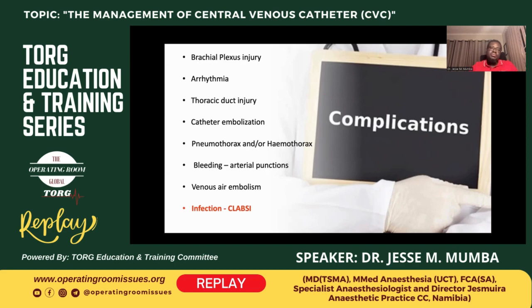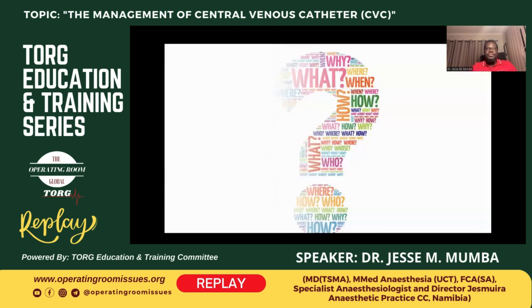and also where you by accident place it into an arterial system or puncture. These are some of the things that we're going to look at, the aids of how to avoid some of these complications. Venous embolism is also there. And I think the big one that we may specifically concentrate on is infection of the central lines. And we will talk about this a little bit further.